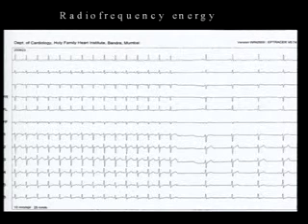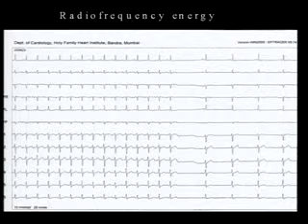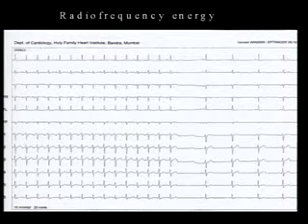Narasimhan, what's your take on the QRS alternans? I found that funny, you know. If you get sinus tachycardia, has anybody heard of QRS alternans in sinus tachycardia? Normal. So QRS alternans in sinus tachycardia obviously should make you think of pericardial effusion, usually malignant. So QRS alternans with sinus tachycardia is a very important sign of tamponade or large pericardial effusion.